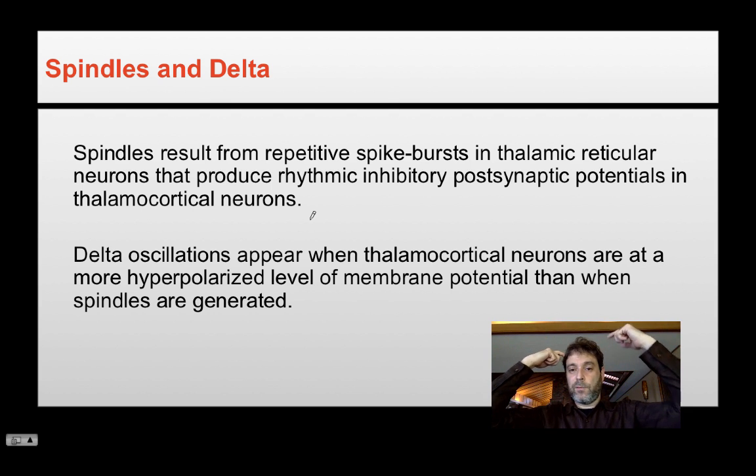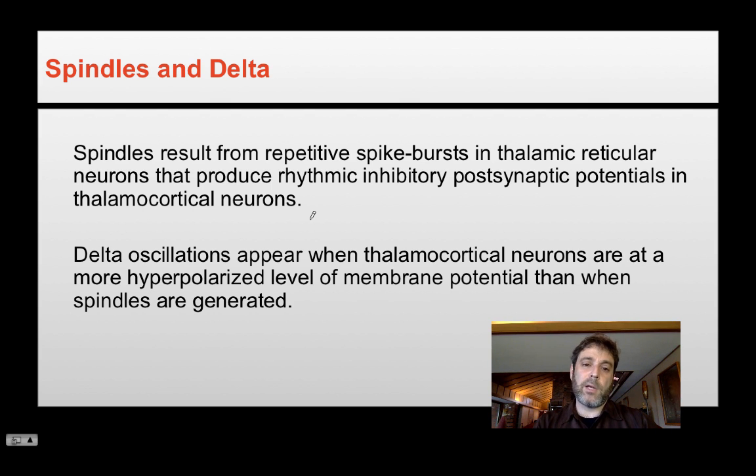So if you looked at a delta wave here and a delta wave there, they wouldn't necessarily be in phase, and that might also reflect an inability to integrate information across the cortex, although these are somewhat hypothetical when we look at the EEG and try to understand what the underlying neurobiology could be.